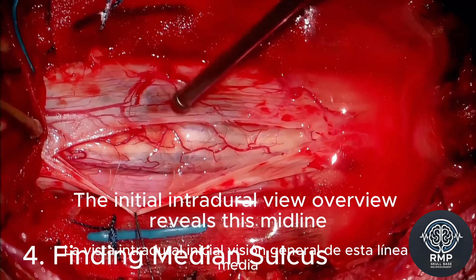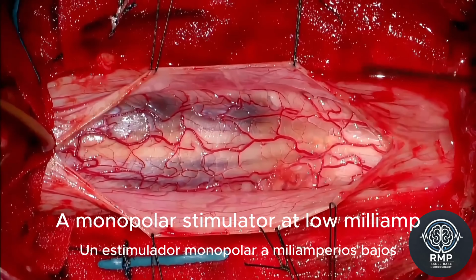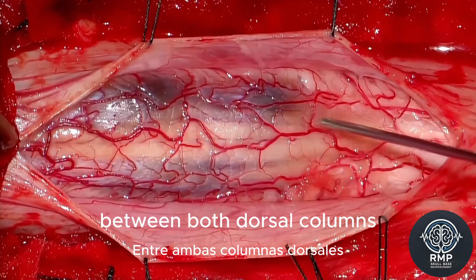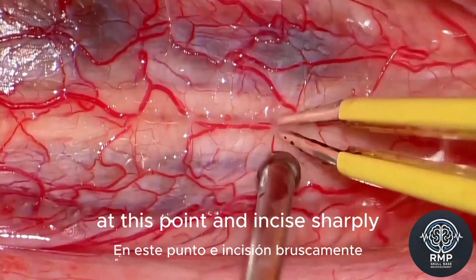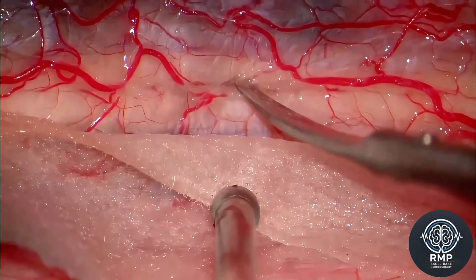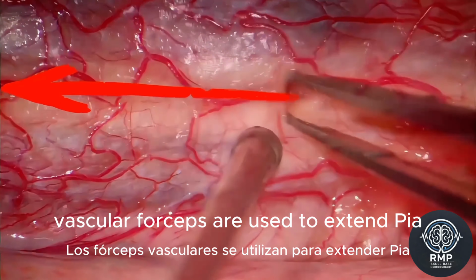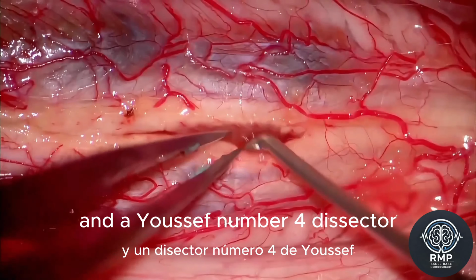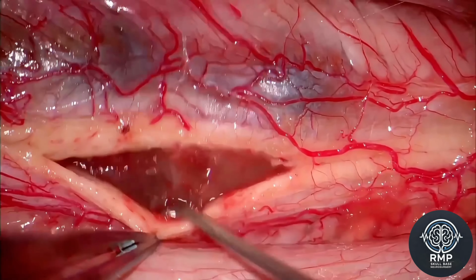The initial intradural view reveals this midline swelling over the tumor. A monopolar stimulator at low milliamp is used to localize the posterior median sulcus between both dorsal columns. The pia is coagulated with bipolar at a very low setting at this point and incised sharply. Vascular forceps are used to extend the pia incision over the margins of the tumor, and a Yasargil number 4 dissector is used to create a plane between the dorsal columns and the tumor itself.